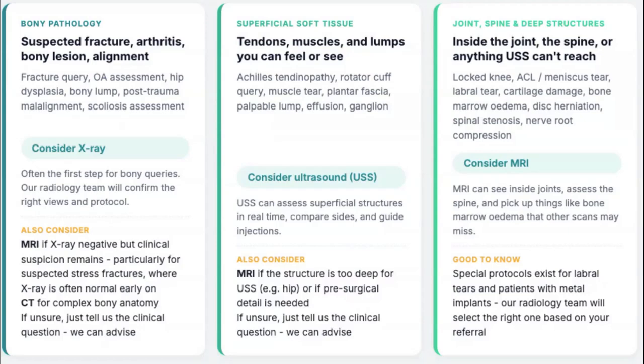If, however, you've got a patient who has what we call inflammatory arthropathy, this is rheumatoid arthritis, they can have inflammation of the joints, of the soft tissues around the synovium of the joints and the tendons. In that case, you could do an ultrasound scan, which is really very good for soft tissue detail. You put Doppler on there and you can see the inflammation.